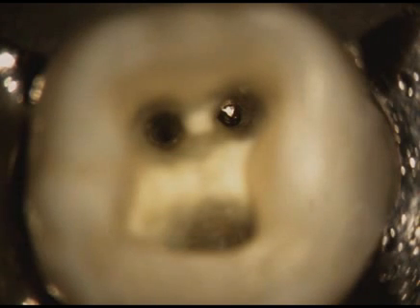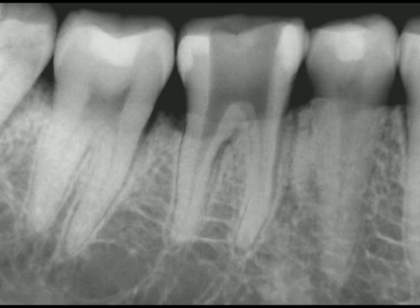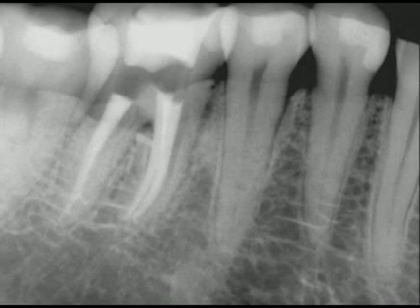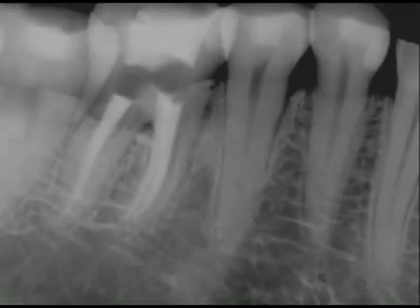I utilized a prototype IRS device to scoop up the obstruction, and a subsequent radiograph confirms the removal of the broken file. The post-treatment film demonstrates the pack. Notice the furcal canal and the distal system bifurcating apically.